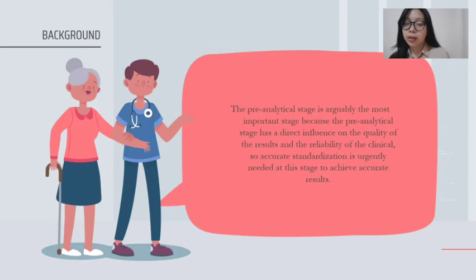The pre-analytical stage is arguably the most important stage because it has a direct influence on the quality of the result and the reliability of the clinical. So accurate standardization is urgently needed at this stage to achieve accurate results.